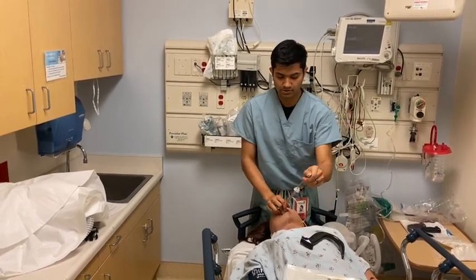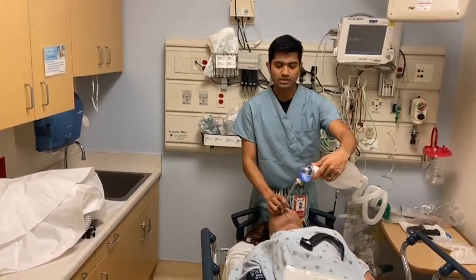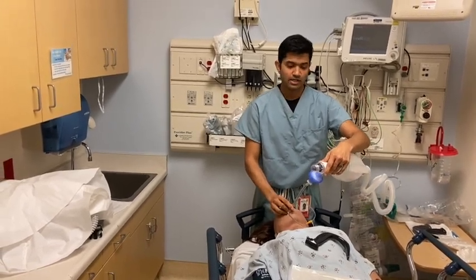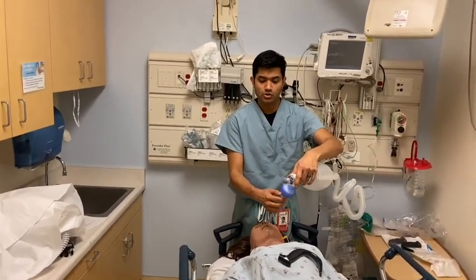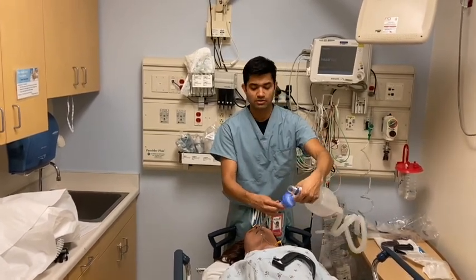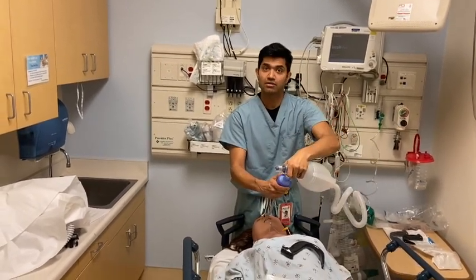Take out your stylet, and what would actually happen is that you would connect your viral filter to the tube. Now, if you were going to be putting on end-tidal CO2, or inline end-tidal CO2, you would not disconnect this portion. This is what's being exhaled from the patient. You would be disconnecting that portion, attaching end-tidal CO2, and then attaching the ambubag there.